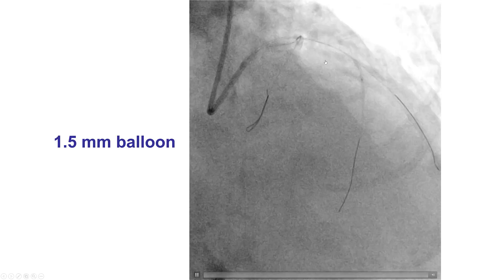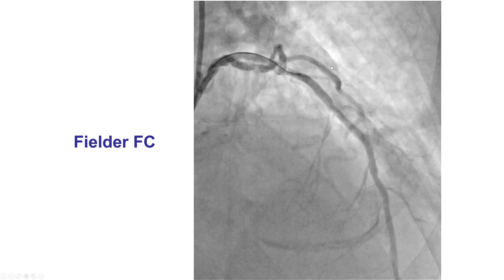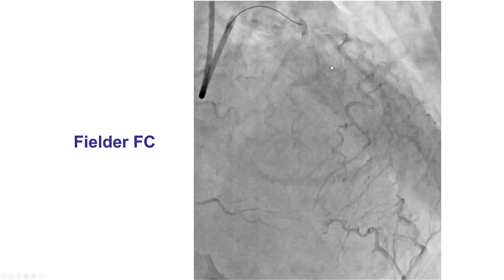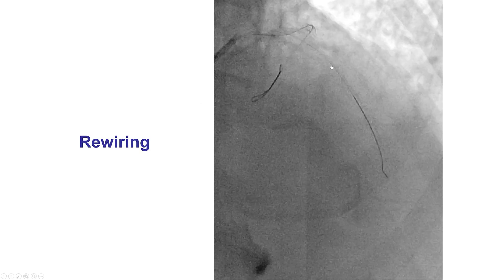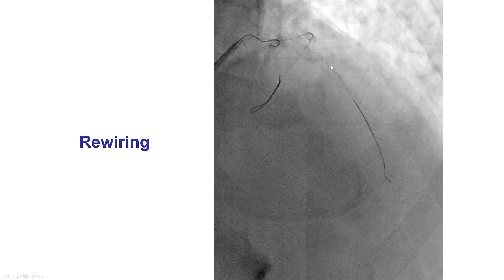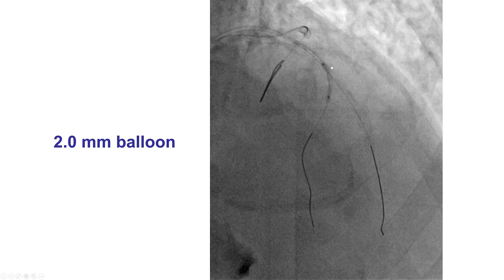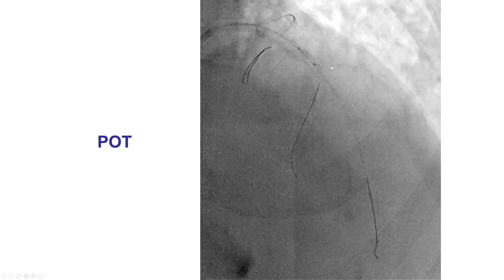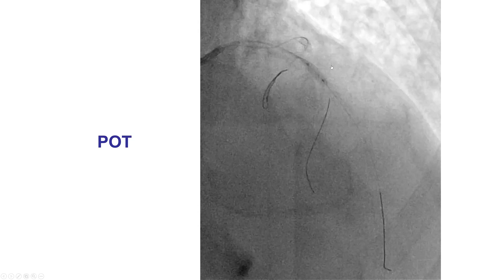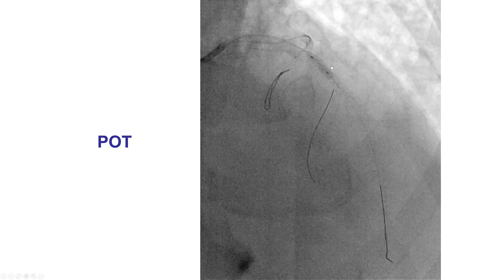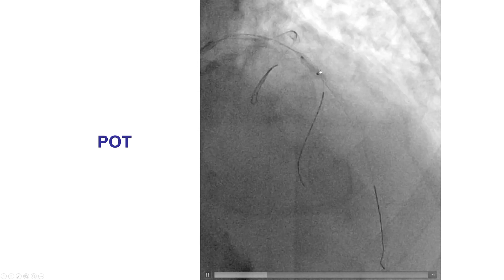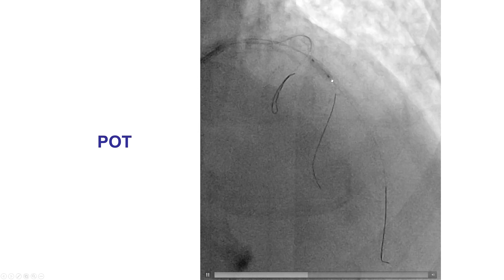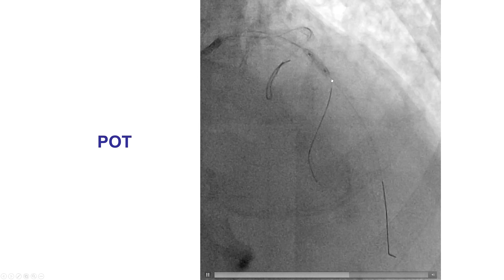We then dilated with a 1.5 mm balloon and then used a 2.0 mm balloon. There was good flow but not perfect, so we rewired and then used a 2.0 mm balloon again. To avoid deformation of the main vessel stent, we did the proximal optimization more proximally with a 3.0 mm balloon.